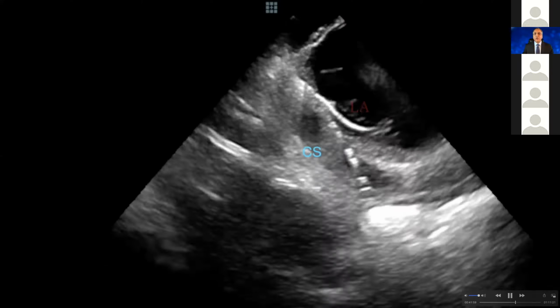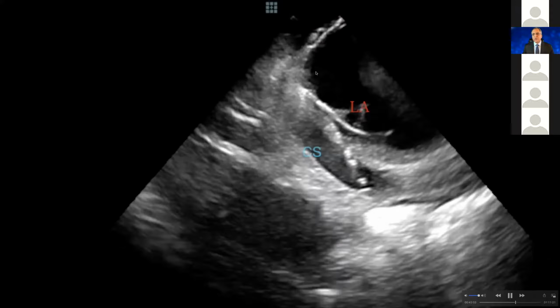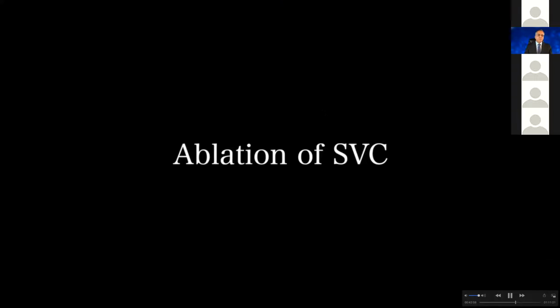And here, I'm doing the endocardial aspect of the very coronary sinus that I was burning. So I'm doing the LA part of that. I was doing the epicardial, now I'm doing the endocardial.